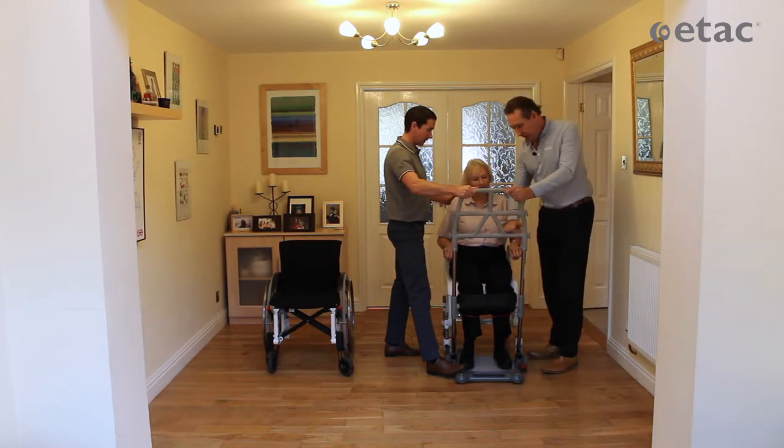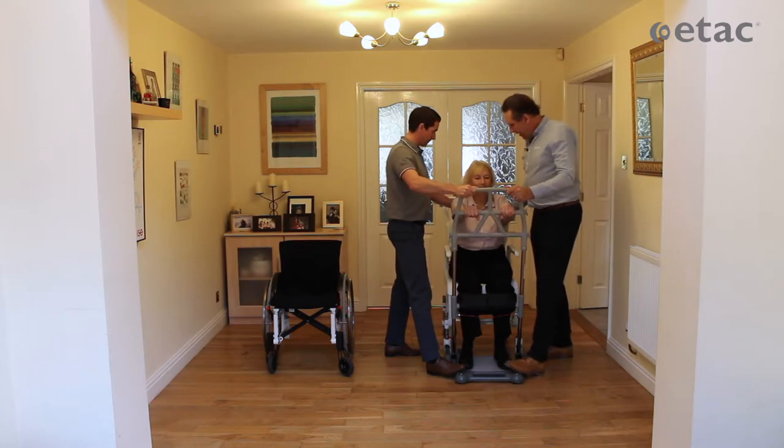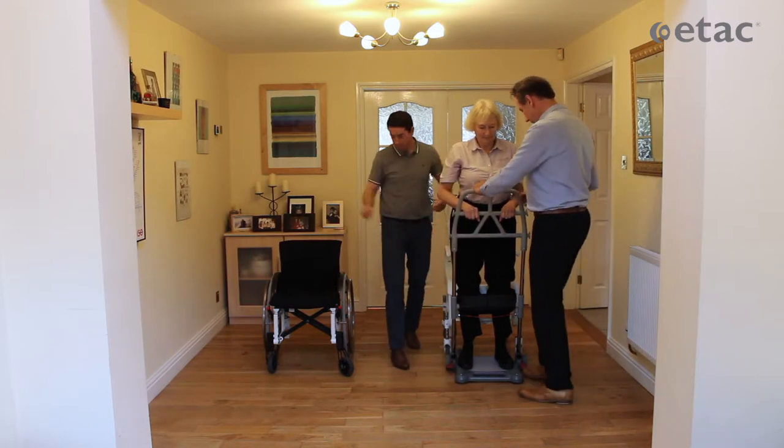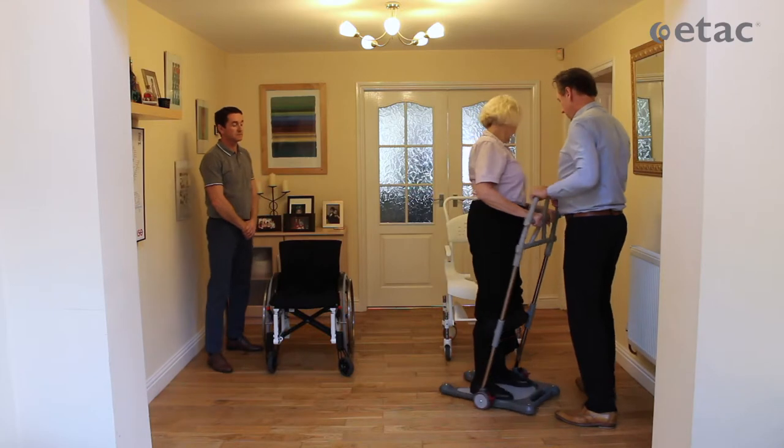I'd like you to find a grip that you feel comfortable with with both your arms, and when you're ready, stand up. Ready? Up you go. Now you can lean forward if you need to — it's just a short distance to transfer you to your chair.